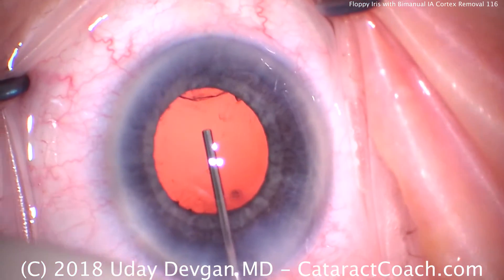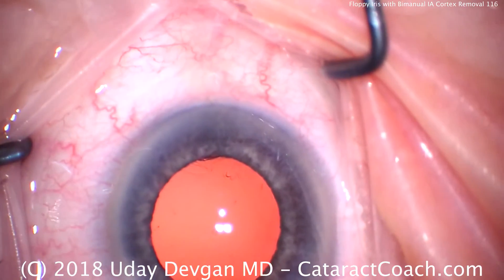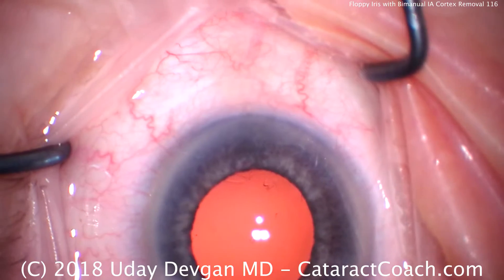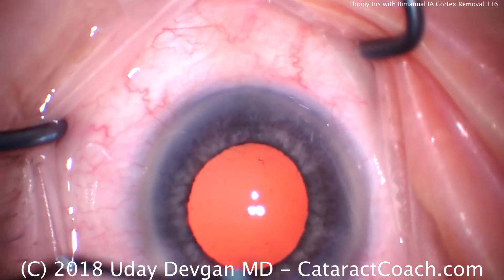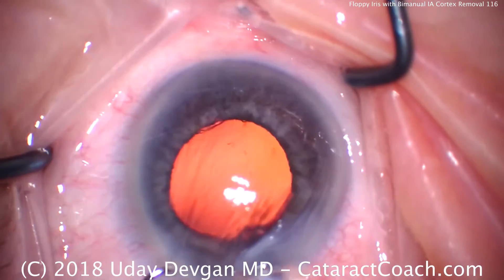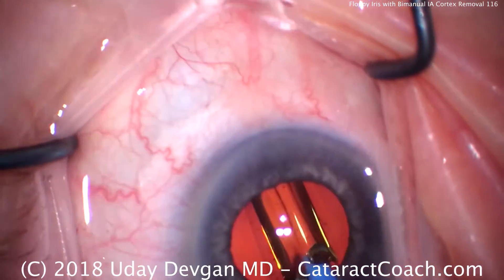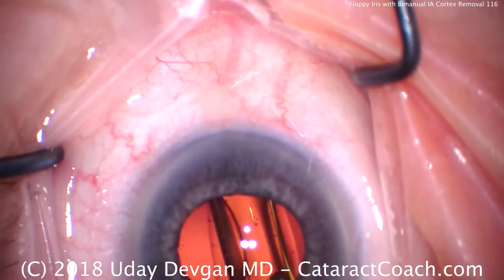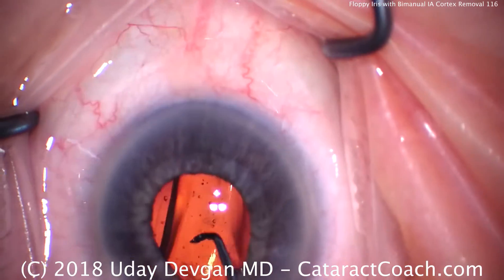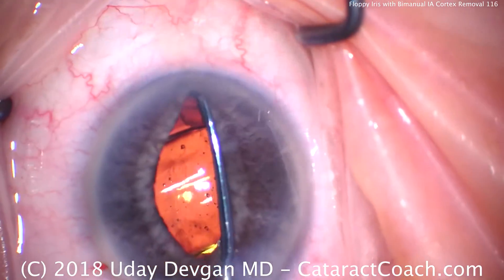Fill up the capsular bag — oh, there's some cortex there nasally. Do you see that? Got to remove that. It's important to check and lift up the iris after we get the lens in to make sure we got all the cortex out. There comes the lens — leading haptic, optic — get that whole thing in the capsular bag, taking our time. Give a little rotation; the rotation will also allow those haptics to help loosen up any remaining cortex.